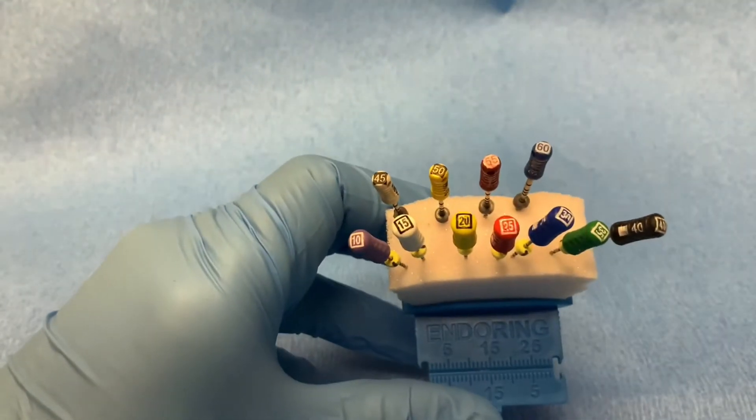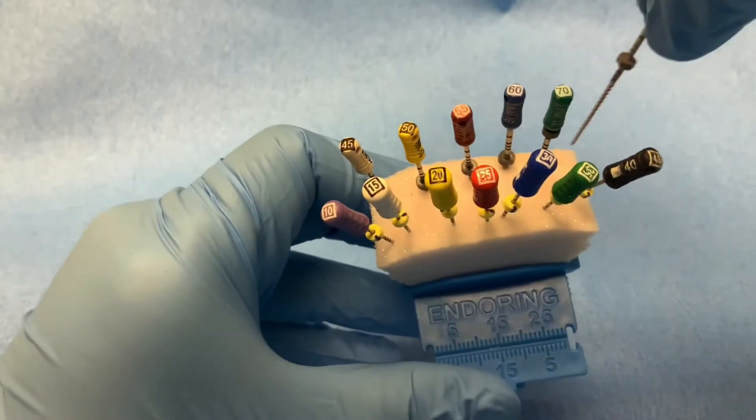As you can see, each file has a designated color and number indicated on the head of each file.